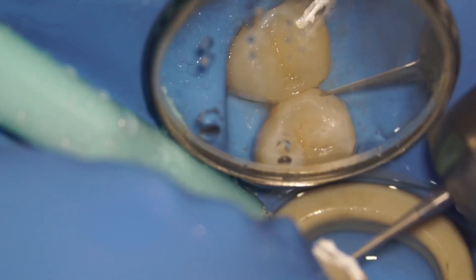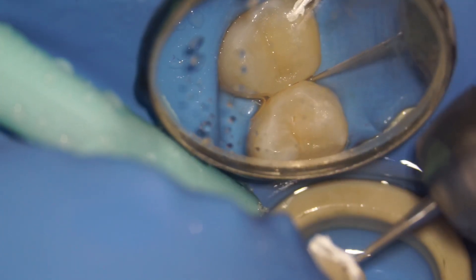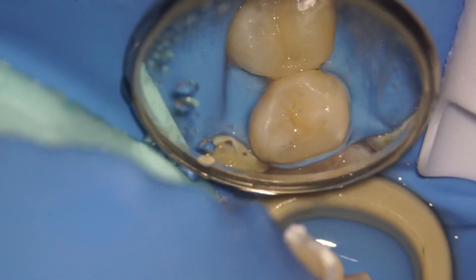Using a microscope is a very big advantage — you get to see micro details, which is not a luxury everyone can afford, but that's okay. You can start off with loupes and then make your way up to a microscope. Remove any excess and round off everything so you get that natural, beautiful, untouched look of composite. Then adjust the triangular fossa.